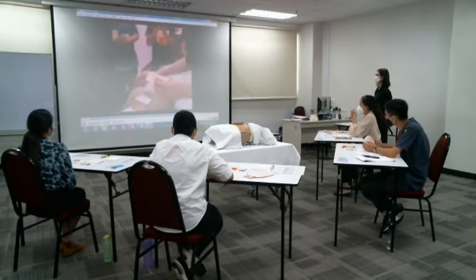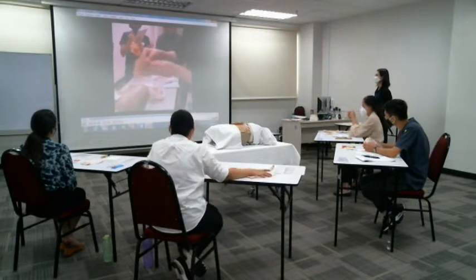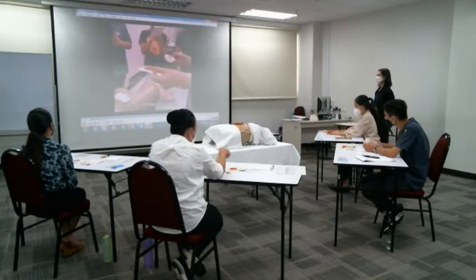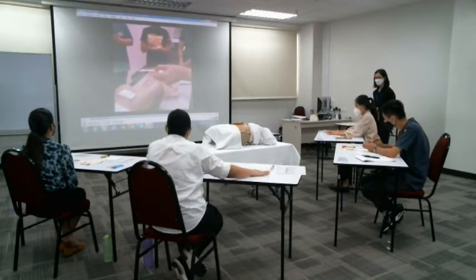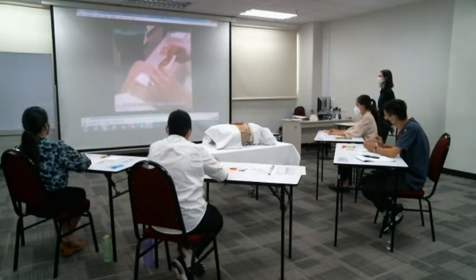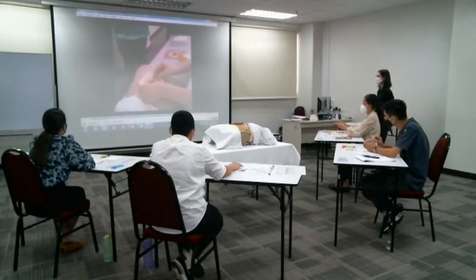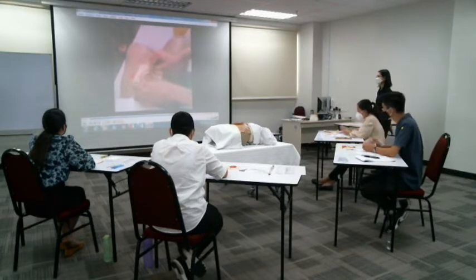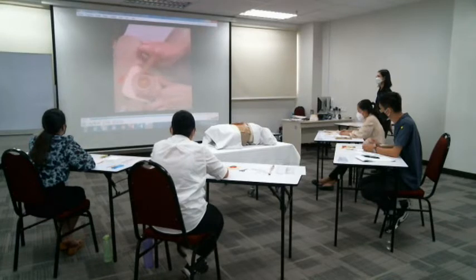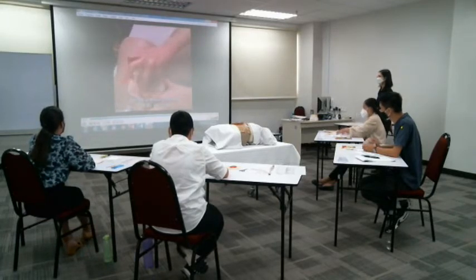Okay, okay. Then now I peel off one part of the backing. Arrow is here, so I must follow. Arrow is towards the patient. Okay. Then I smooth the area. So go to make it stick on it. So go down, massage for 30 seconds.